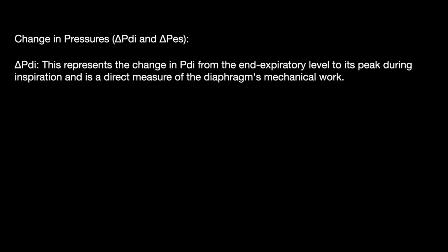Now, what are the changes in the pressures? The delta PDI represents the change in the PDI from the end expiratory level to the peak during the inspiration and is a direct measure of the diaphragm's mechanical work.